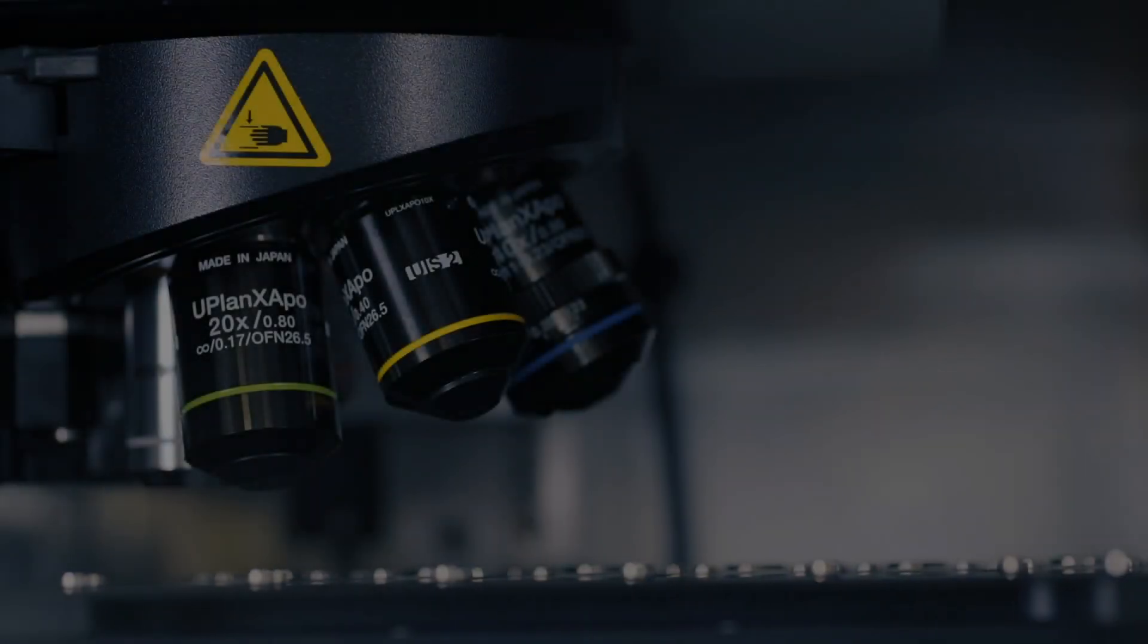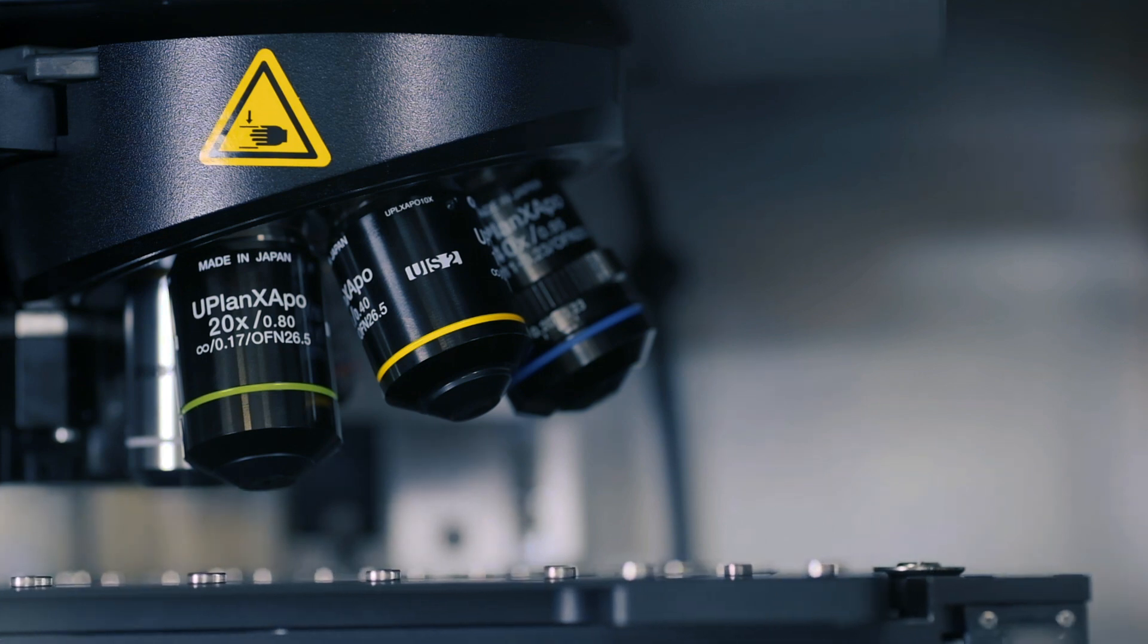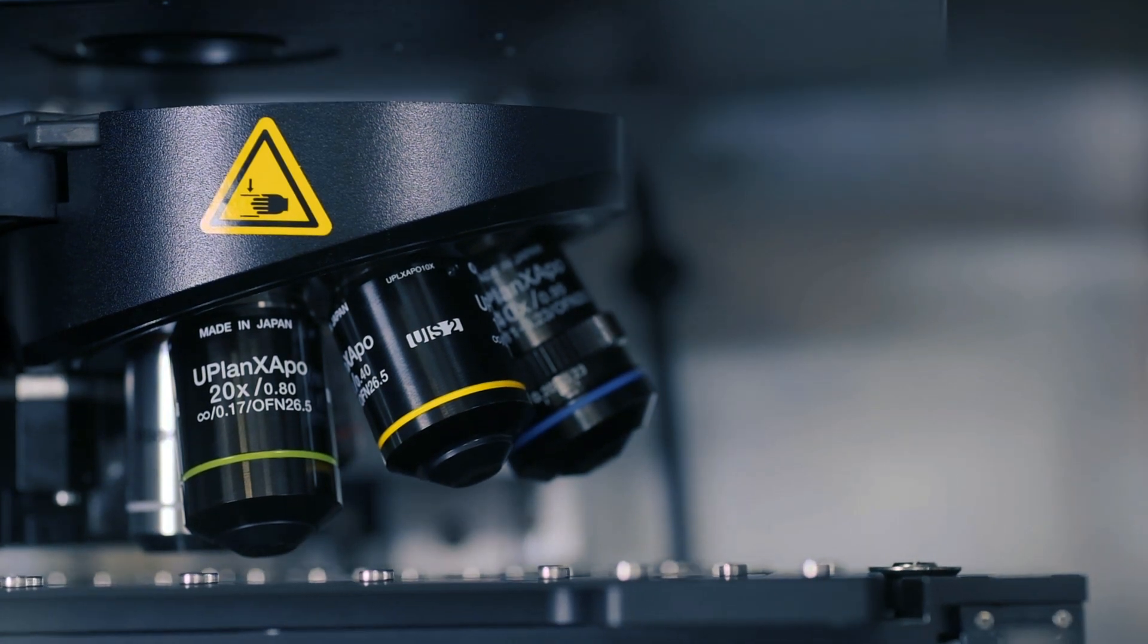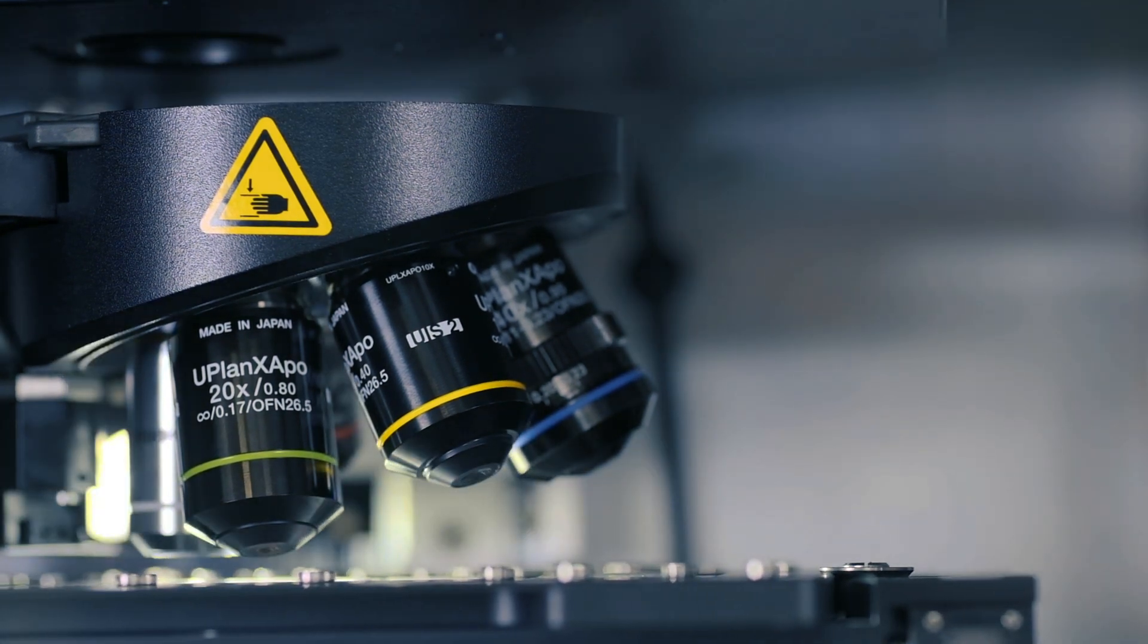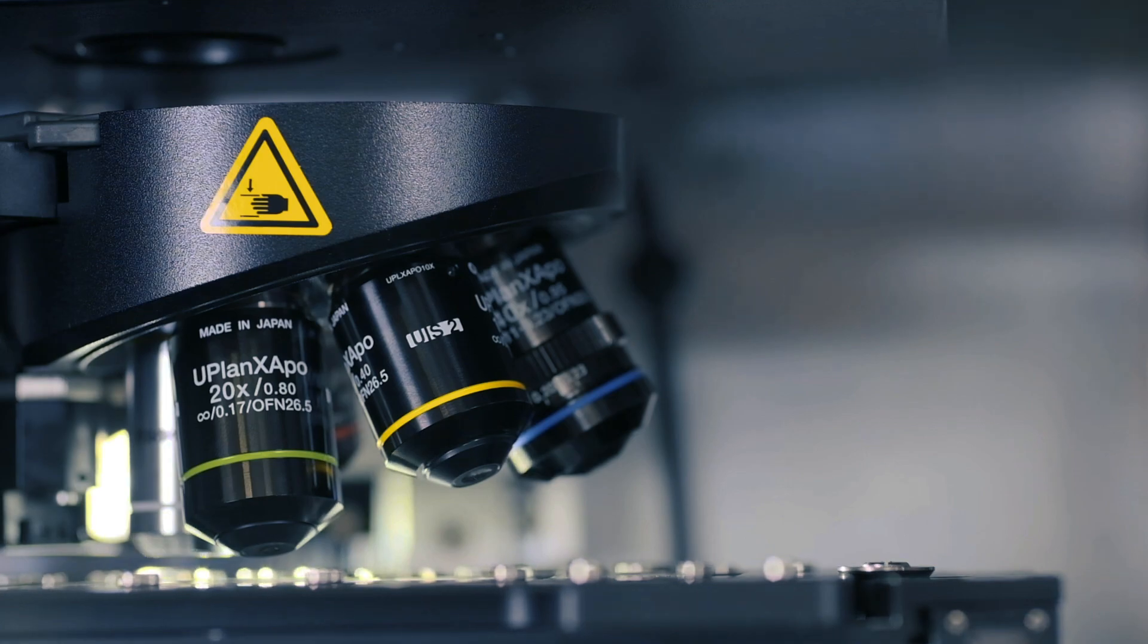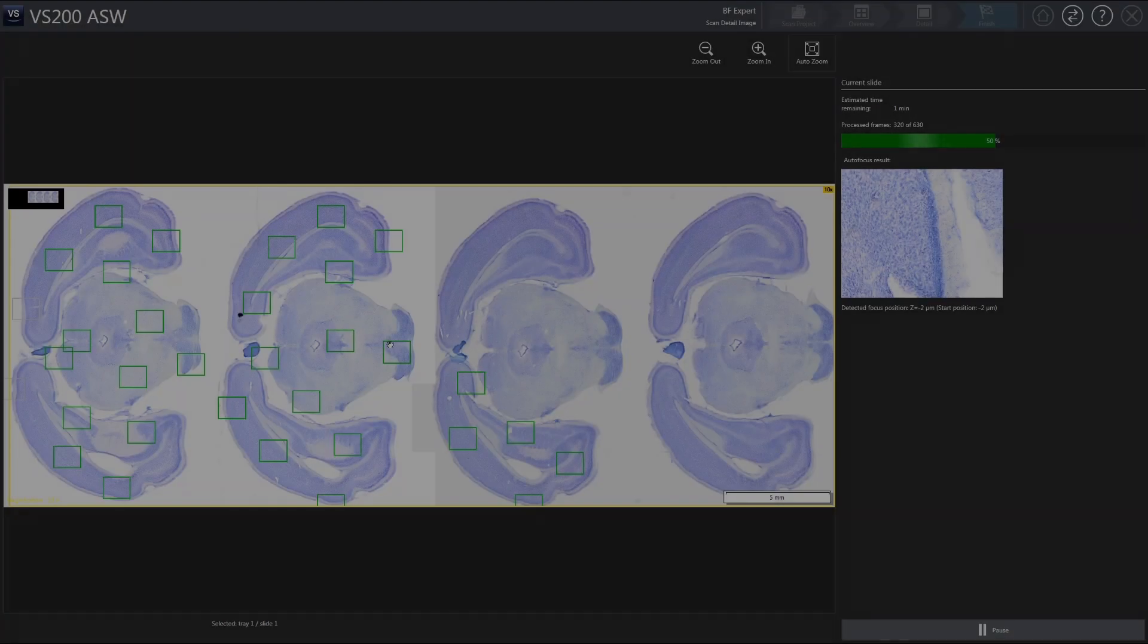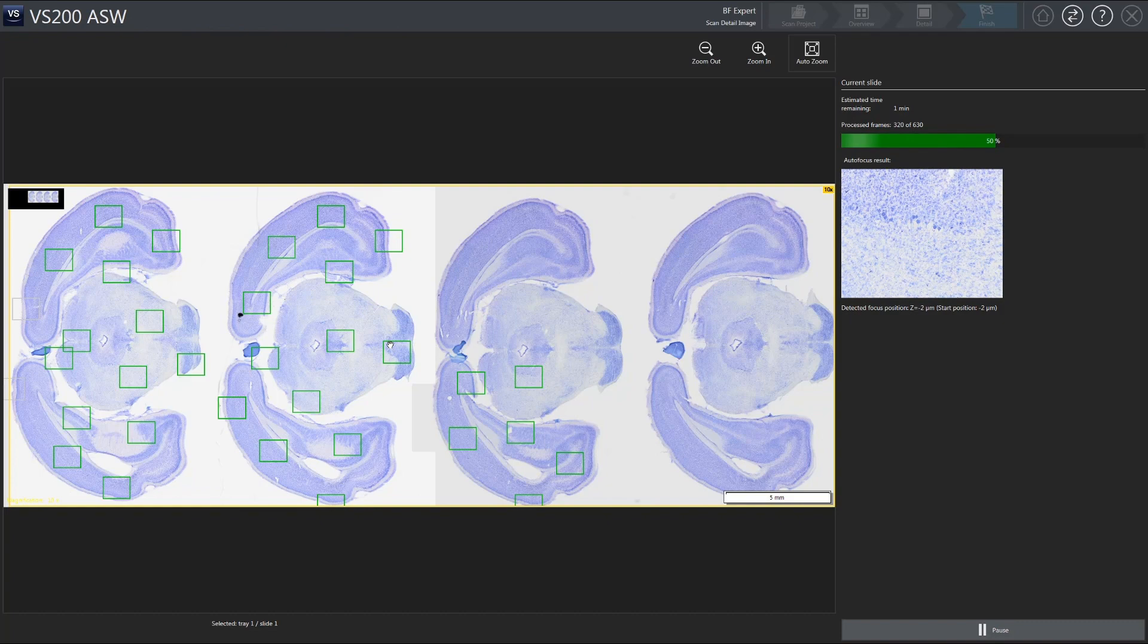The optical system is specially optimized to work with Olympus High Performance X-Line objectives to improve resolution and flatness for precise imaging. The autofocus works accurately across large and uneven sample regions at all magnifications.